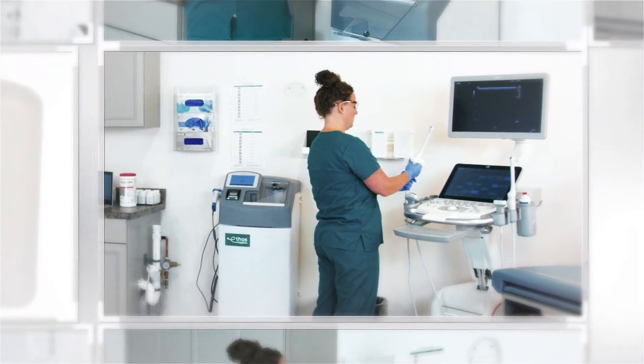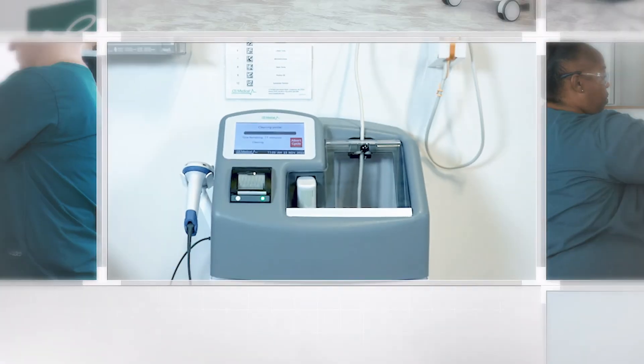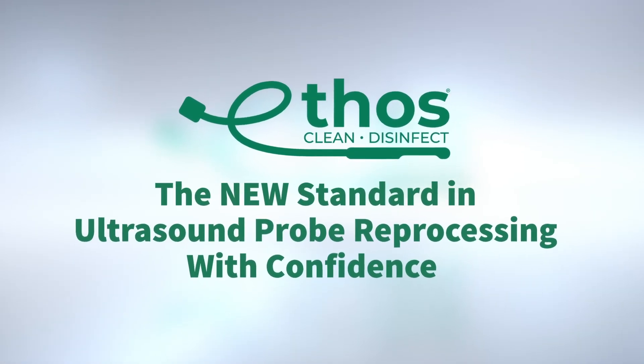Join CS Medical and provide your ultrasound probes with the best solution for reprocessing and reduce the inconsistencies caused by manual reprocessing. Ethos — the new standard in ultrasound probe reprocessing, with confidence.